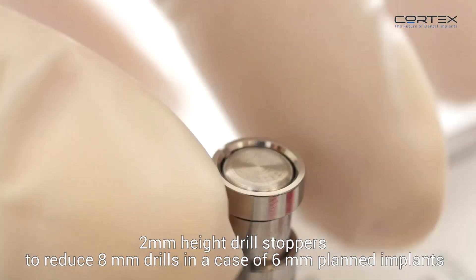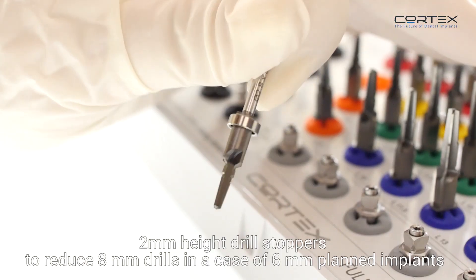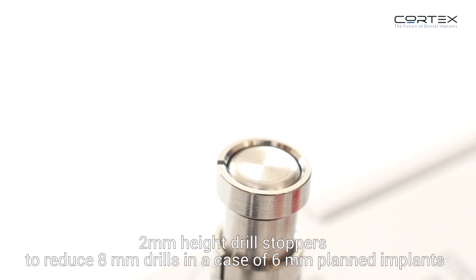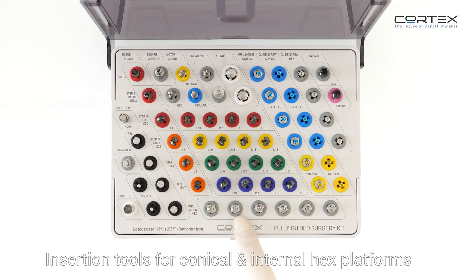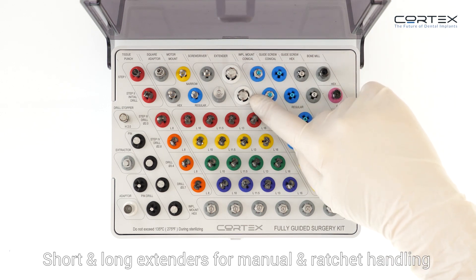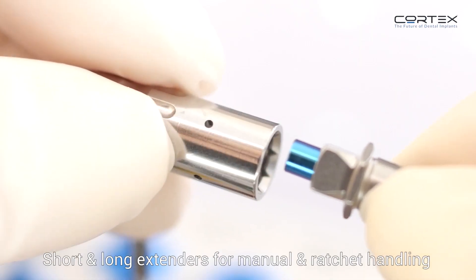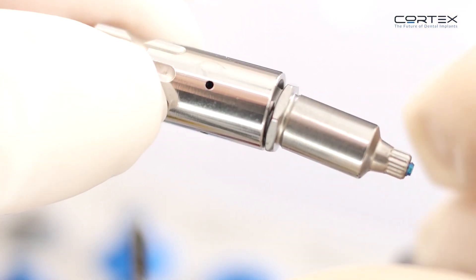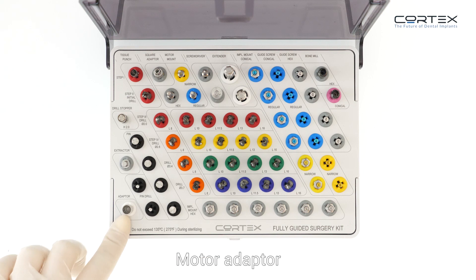The kit also includes 2mm height drill stoppers to reduce 8mm drills in the case of 6mm planned implants, insertion tools for conical and internal hex platforms, and short and long extenders for manual and ratchet handling, plus a motor adapter.